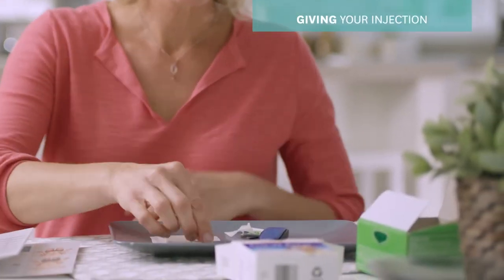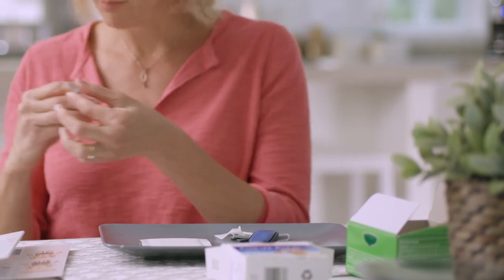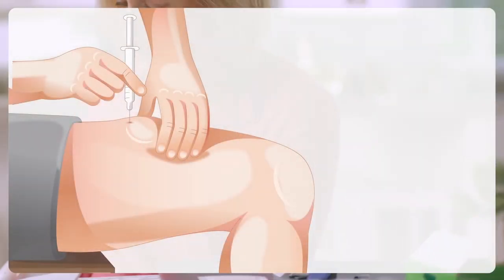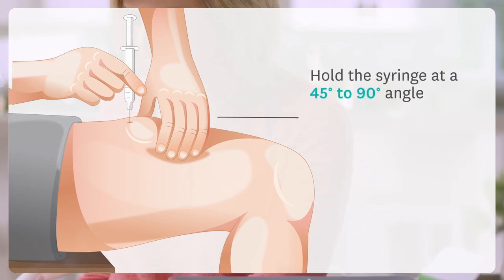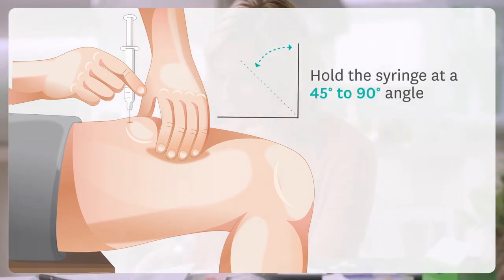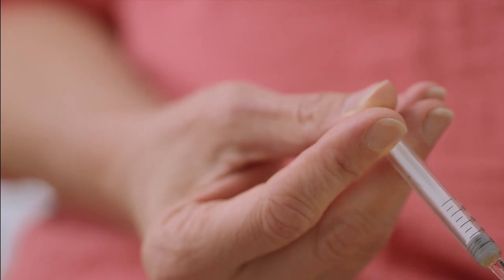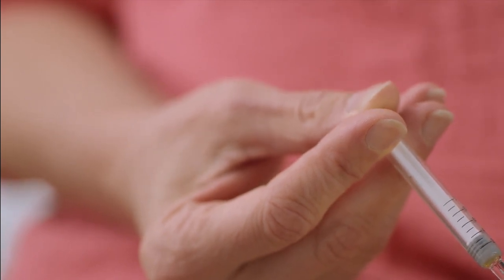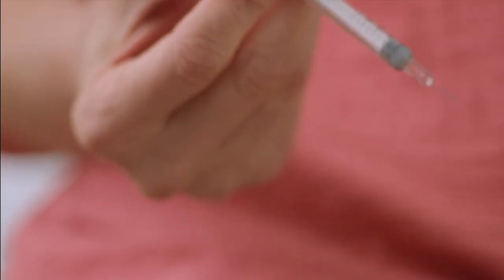To give the injection, hold the syringe barrel and pull the cover straight off the needle. Gently pinch a fold of skin at the cleaned injection site. Hold the syringe like a pencil at a 45 to 90 degree angle to the skin and insert the needle into the skin with a quick dart-like motion. Slowly push the plunger all the way down to inject Kinneret. When the syringe is empty, pull the needle out of the skin while keeping the needle at the same angle.